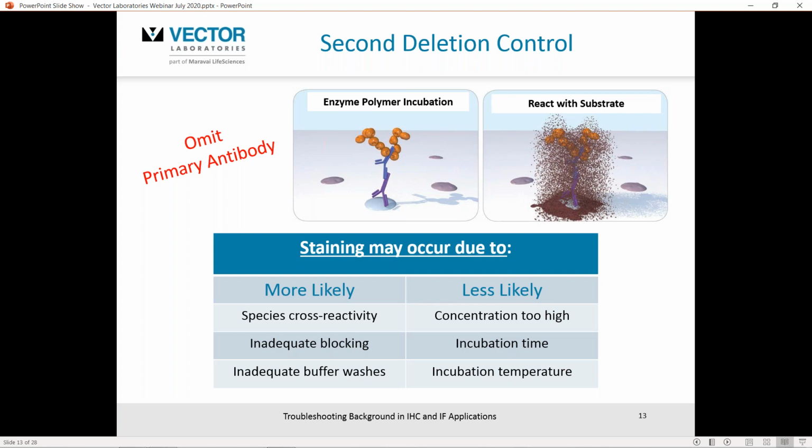If you do see staining under these conditions, more than likely, from my experience, it's going to be due to species cross-reactivity of that secondary detection reagent, either with something inherent in the tissue or the detection reagents, potentially inadequate or inappropriate blocking, or possibly inadequate buffer washes, skimping on those buffer washes. Less likely would be a concentration factor or indeed incubation time or temperature.